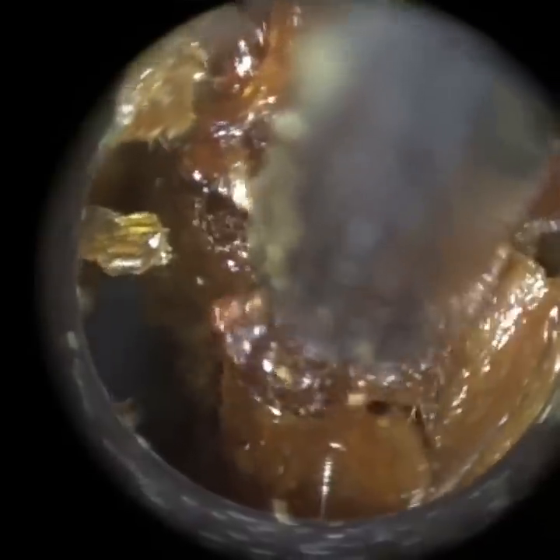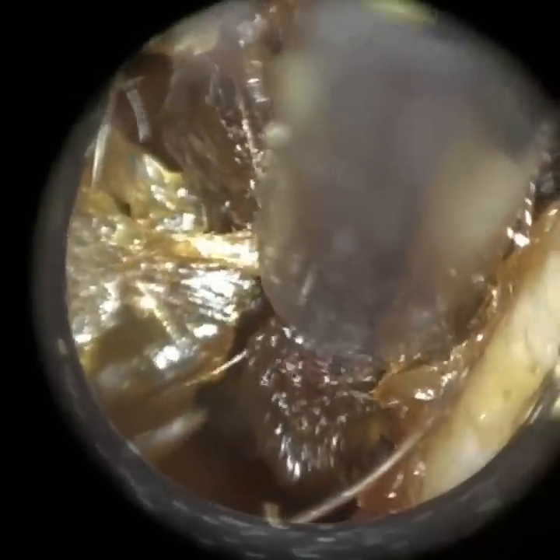So as you can see with this wax, it's really impacted — it's fully occluding. I'm slowly extracting it forwards near to the entrance. There's a lot of dead keratin around the edge, around the perimeter, which is still attached to the canal wall. With the WaxCope, what's really fantastic about it is that you can actually see the dead skin, the keratinous skin — it's very glossy in appearance, and you can actually see the texture, the ripple effect on the skin itself.